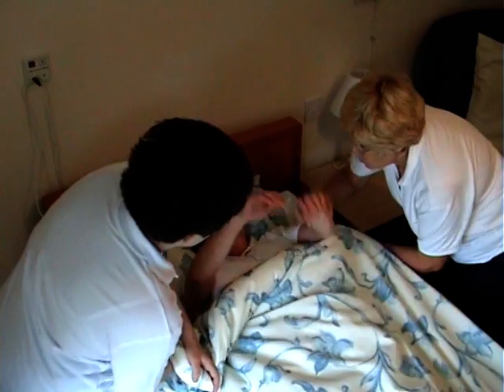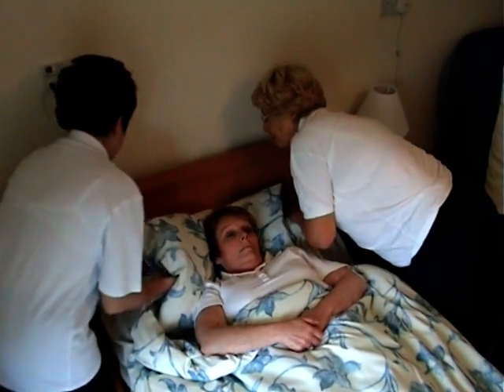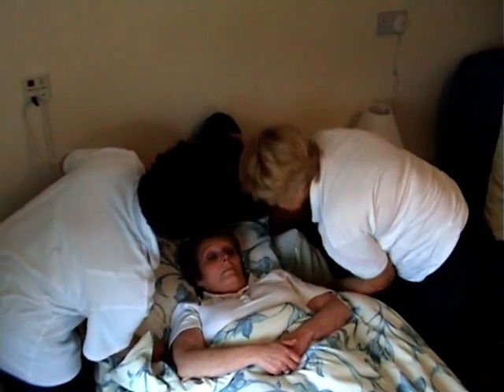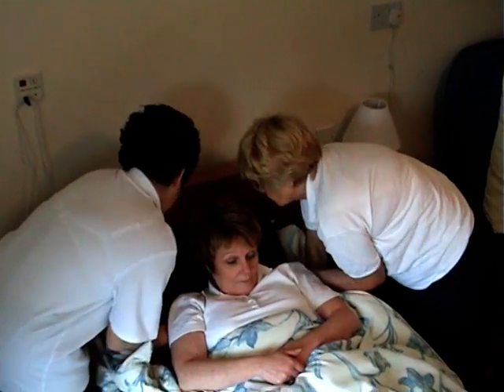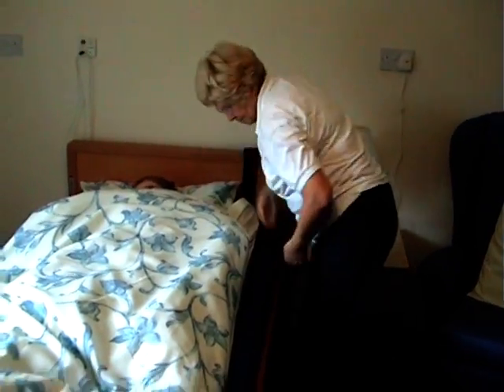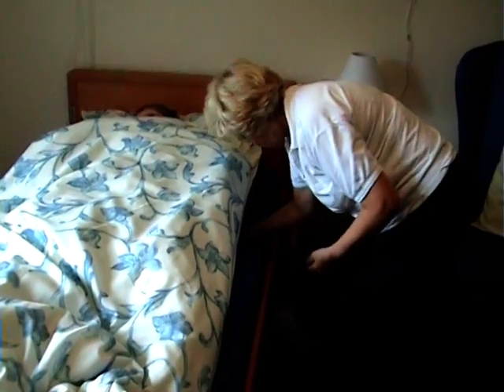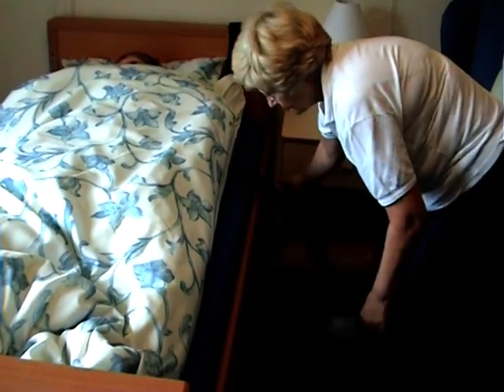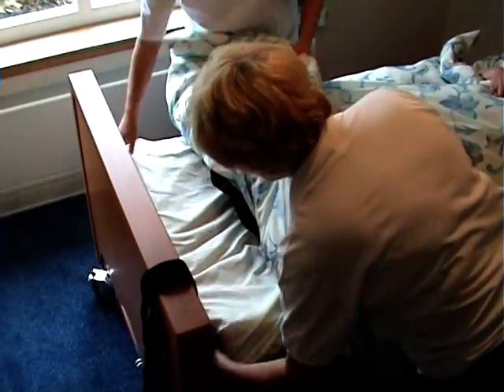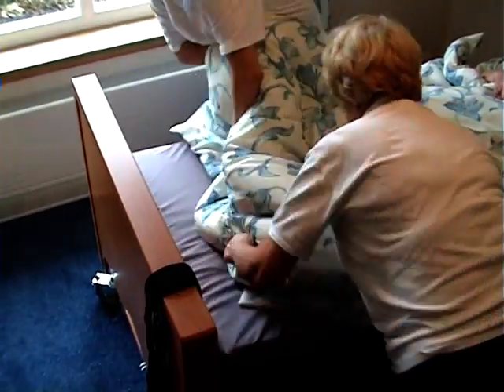How to use the fire evacuation devices. Take the flaps from under the ProPad and reposition, one over the pillow and one tucked into the bottom pocket. Release the straps at the end of the equipment for use. Now release the straps around the bed. Wrap the service user's feet in the bedding and place in the pocket at the bottom of the ProPad.